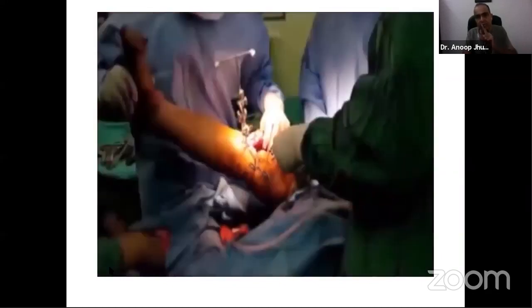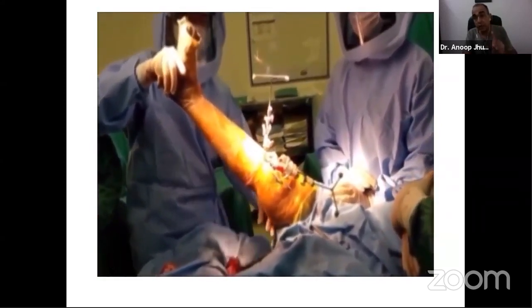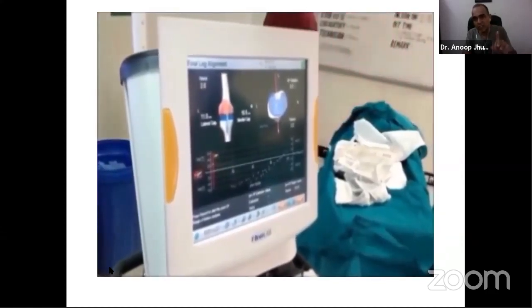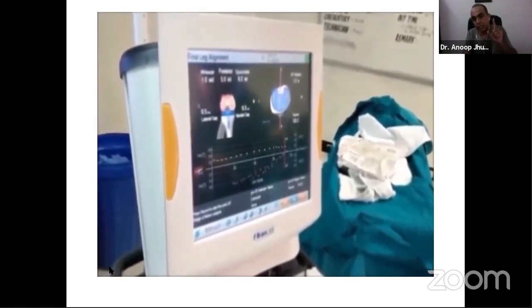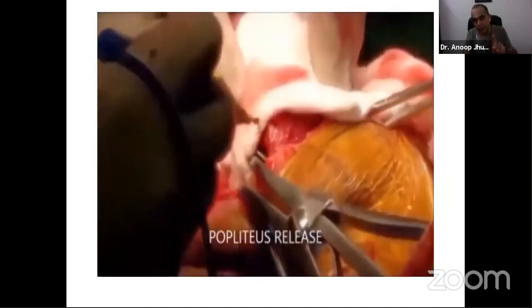It doesn't have to be sudden release. It has to be a graded, guarded release under control. And because we have navigation, we have data in front of us as to where we want to leave our knee. And you can see here, we have 2-degree valgus and 5 degrees of flexion. What is more important is that the yellow graph that we see now is just above the midline, and that's where we need it to be.